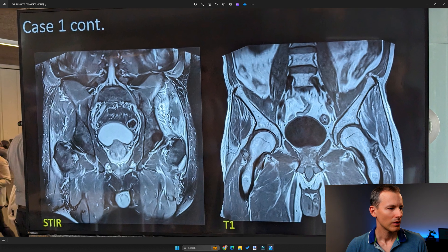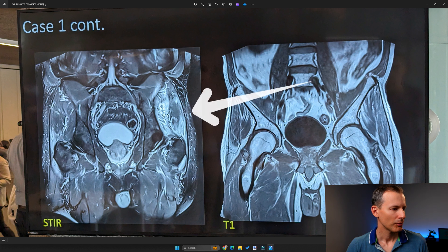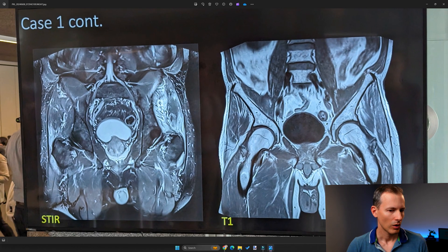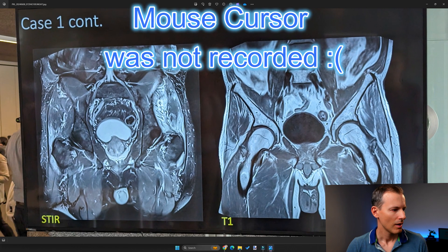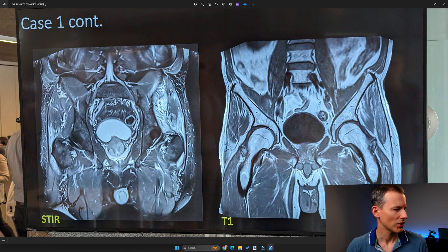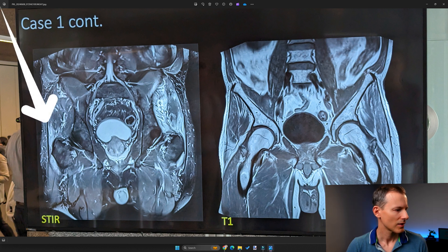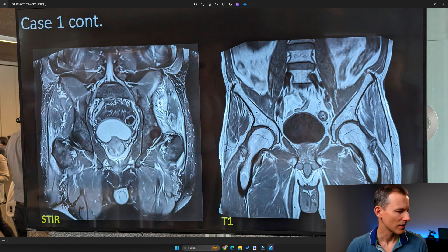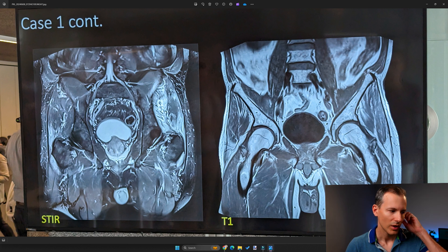On the STIR we can see edema in the abductor muscles, mainly the gluteus minimus and medius, but not all of the muscle is affected — there's a central area that is spared. It goes down around the greater trochanteric region, possibly with a little bit of bursitis — hard to tell on one plane. There is also edema to a lesser degree in the gluteus medius on the right side, and possibly at the origin of one of the quadriceps muscles or adjacent edema below the greater trochanter.